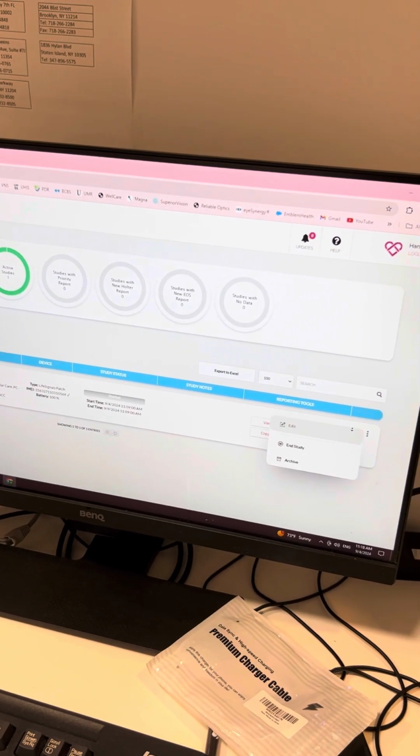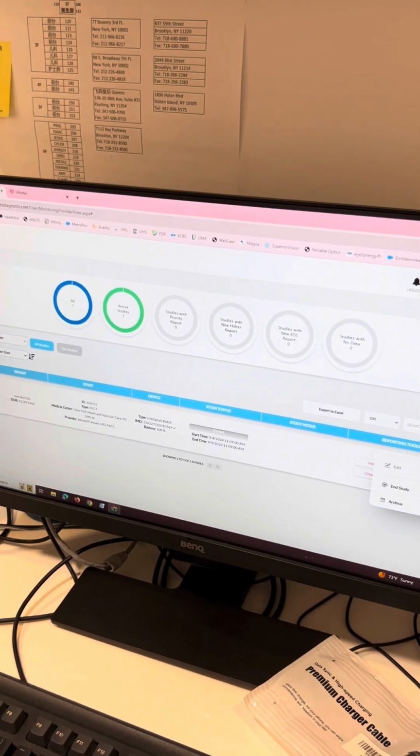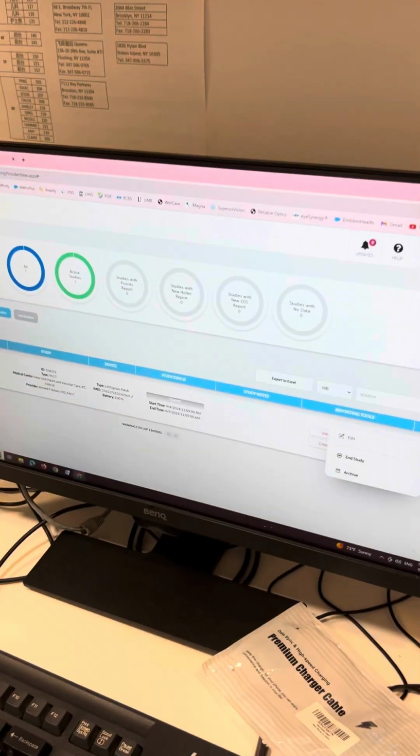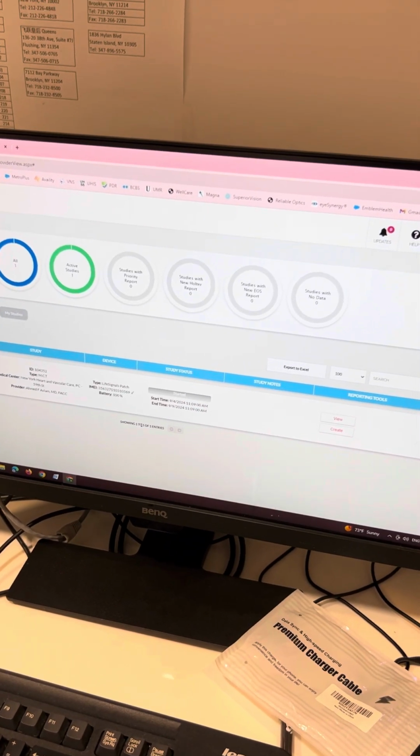Okay, so I can end it right now. No, don't end it. Wear it until the patient comes in. Let's make sure you're healthy. I'm healthy. You don't want to know? Yeah. Nobody wants to know. Just keep wearing it.